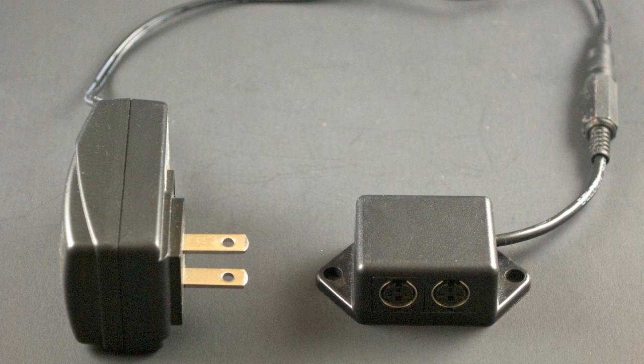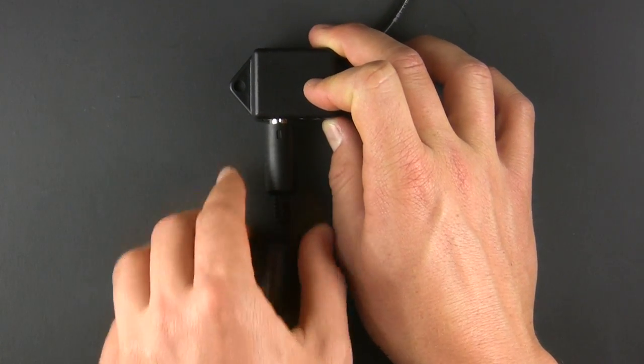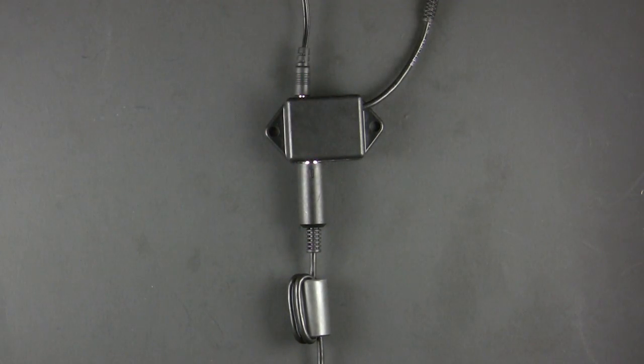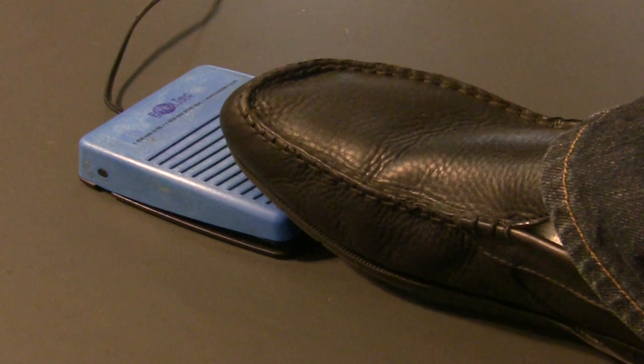The junction box that is included connects the unit to power and has a second input to allow for synchronization with another unit. A foot pedal can be connected to the smaller opening on the reverse side of the junction box. The foot pedal provides a way to use the LightOne hands-free, and operating it is the equivalent of pushing the Go button.